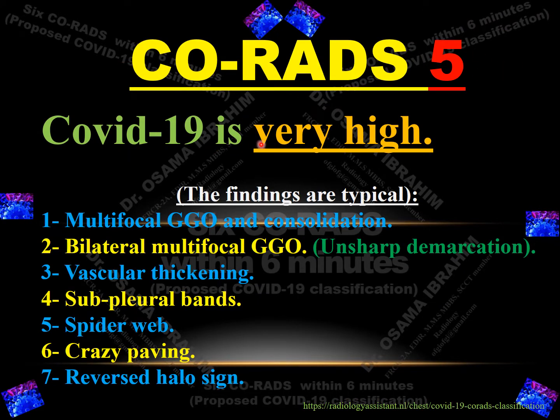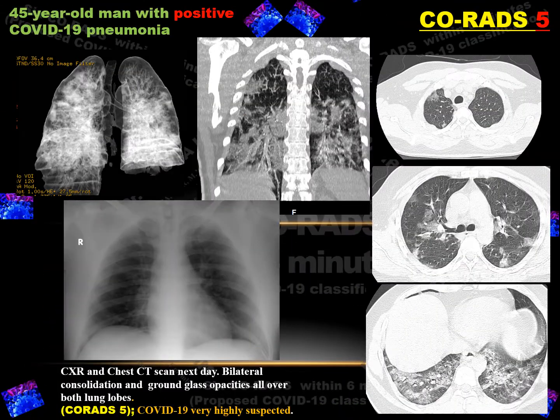The next is CO-RADS 5, where COVID-19 suspicion is very high. The findings are typical for diagnosis of COVID-19 by HRCT. If there are multifocal bilateral ground glass opacity or consolidation, multifocal ground glass opacity with unsharp demarcation, vascular thickening, subpleural bands, spider web sign, crazy paving, or reverse halo signs — these are typical CT findings for COVID-19, classified as CO-RADS 5. A 45-year-old patient with multifocal areas of consolidation, ground glass opacity, and basal consolidations confirmed positive for COVID-19 by laboratory testing.